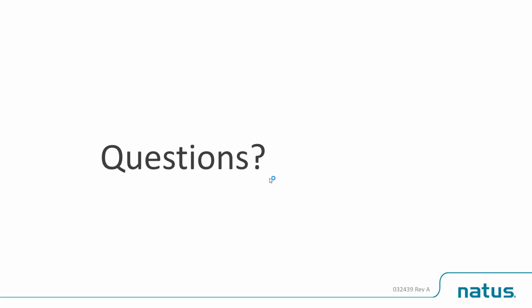Okay, so it's not something that's very common, and we don't actually see that in the United States at all. But I think in the Netherlands, they wrote some really great papers about it, and there's some really nice work. So there's some normal values for it, and in our software, those interstimulus intervals and things like that, they're all built in. So it's pretty easy, other than you've got 3 stimulations, you know, it's electrical stim, magnetic stim, like boom, boom, boom. And I've had it done on me, not a lot of fun. Okay. So central conduction time is the key.